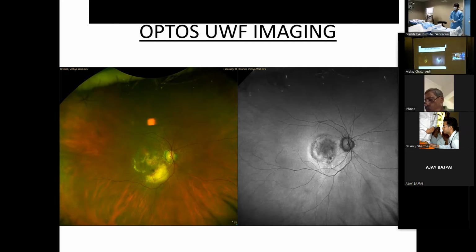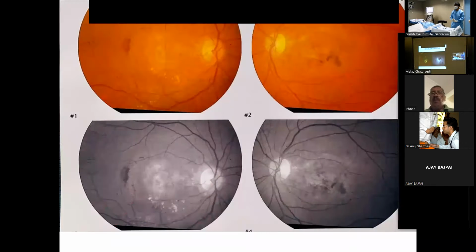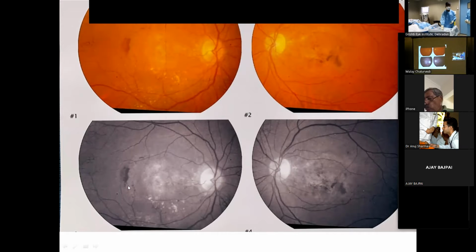which is showing that there is some scarring CNVM formation in the macular part, and this can also be seen on the autofluorescent imaging of the same. So this is the colored fundus photo taken on the Topcon machine, and this shows that there is some activity going on in this wet ARMD, showing the scarring CNVM and a hemorrhagic part also.